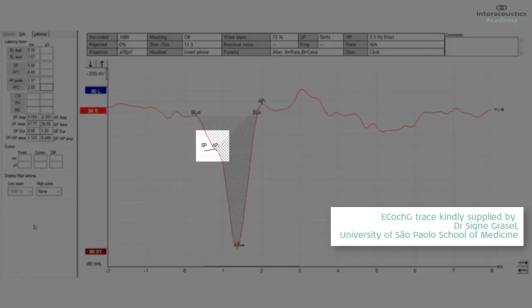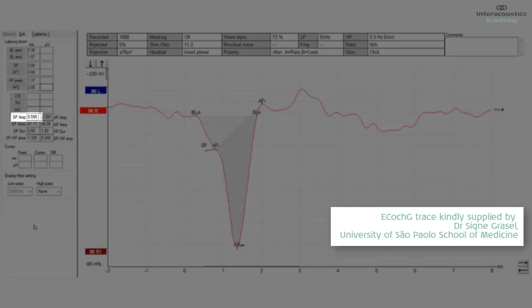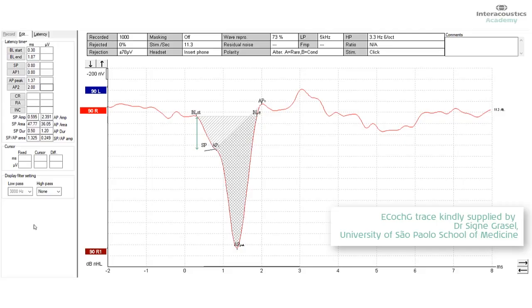SP AP 1, that's kind of a combination. SP represents where the SP ends in this particular case, and so the amplitude of the SP will be the difference between the amplitude at baseline start and the amplitude where it says SP AP 1. In this particular case, the SP ends and the AP starts at the same point, which is often going to be the case.